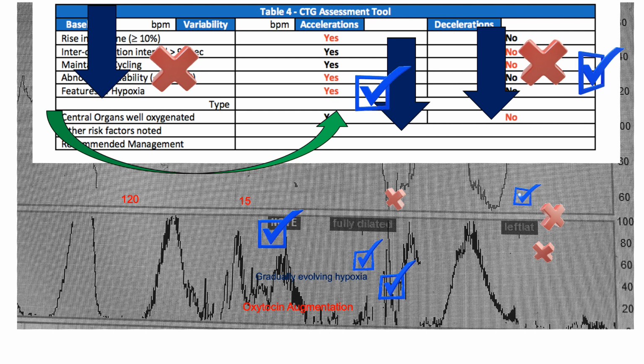Let's look at the intercontraction interval. This is the time available for the fetus to get fresh oxygen from the placenta. Scientific evidence shows that in spontaneous labor, we should be aiming for 90 seconds to prevent desaturation of the fetus. Donald Peebles' team in 1994 published a paper in the British Journal where they showed that if we use oxytocin, this intercontraction interval should be approximately 2.3 minutes.